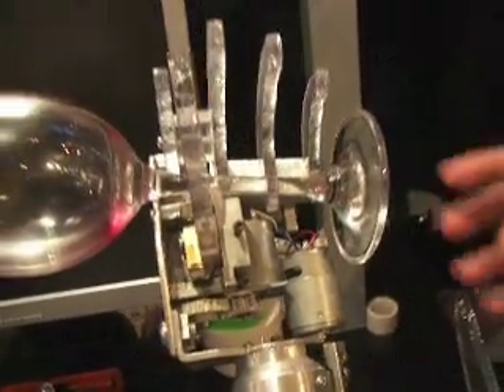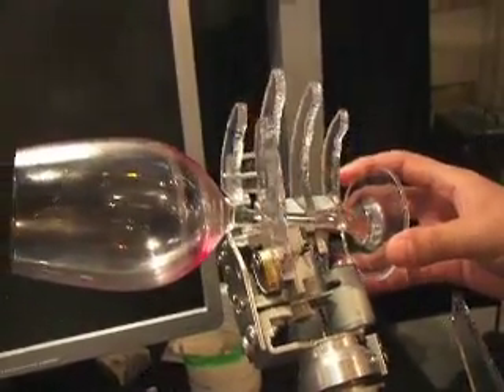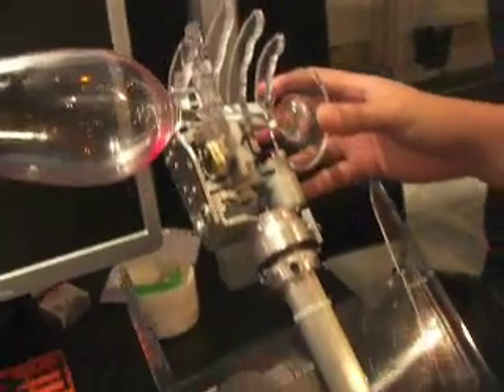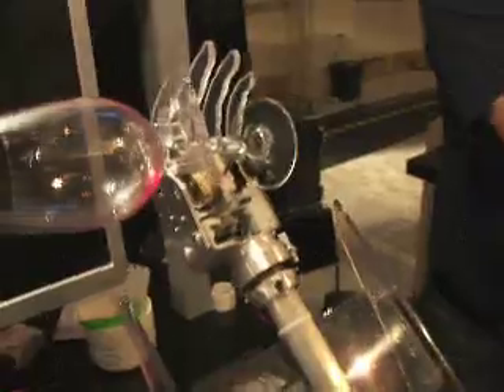It has 4 movements: open and close, and left and right rotation in the wrist.